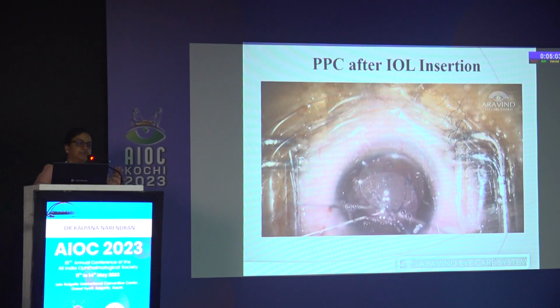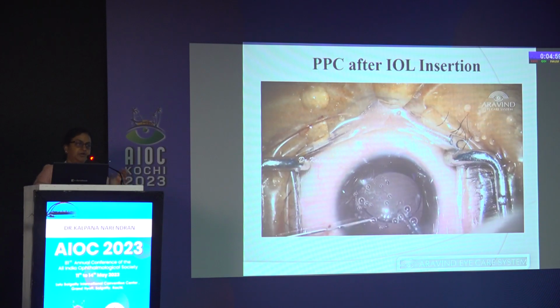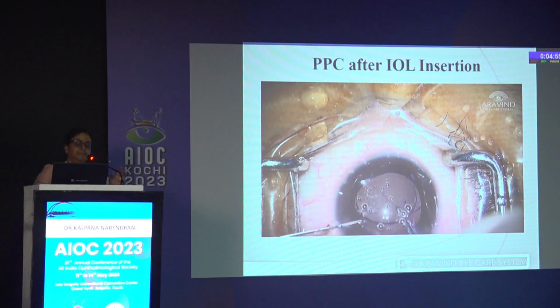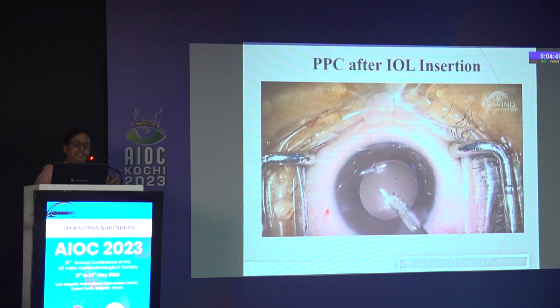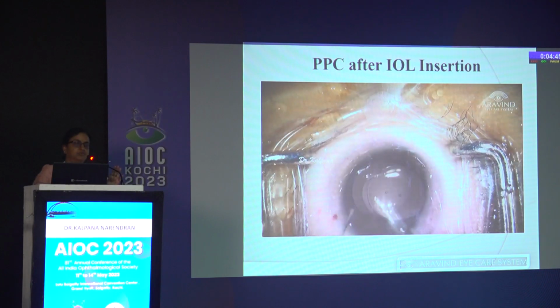And a primary posterior capsulotomy, which we normally don't do in adults. That is very important to keep the visual axis clear, especially in children below the age of 8-9 years. Just doing a good cataract surgery does not suffice. You should do a good primary posterior capsulotomy with anterior vitrectomy. That is very important. And it's better to suture the wound.